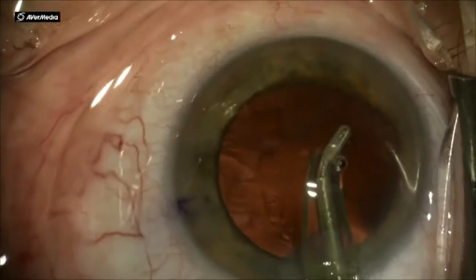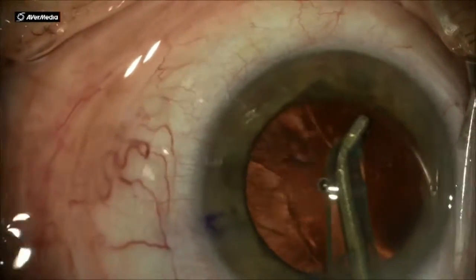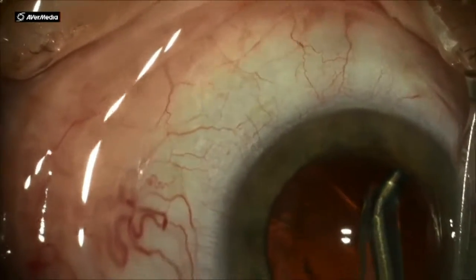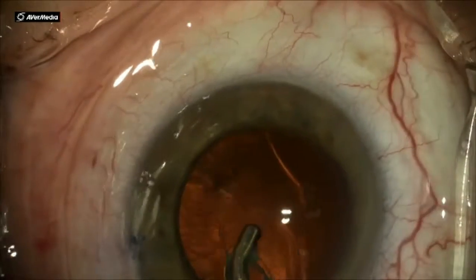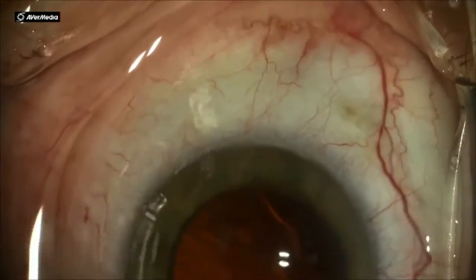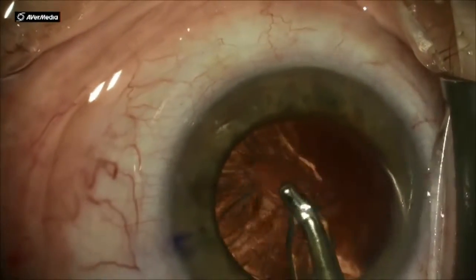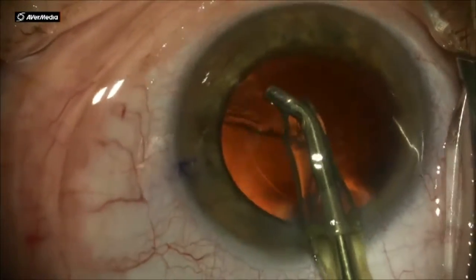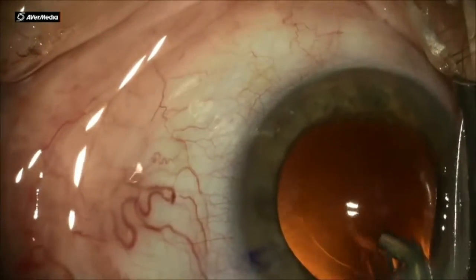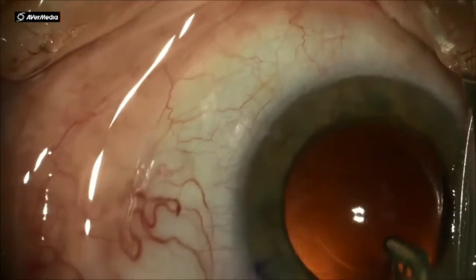IA is irrigation aspiration. I always start sub-incisionally — that is the most difficult cortex to remove. Once I have the sub-incisional cortex out, I usually go counterclockwise or clockwise, it doesn't matter, and go 360 degrees and remove all the cortex. Here you can see I still have a little tuft of cortex sub-incisionally.